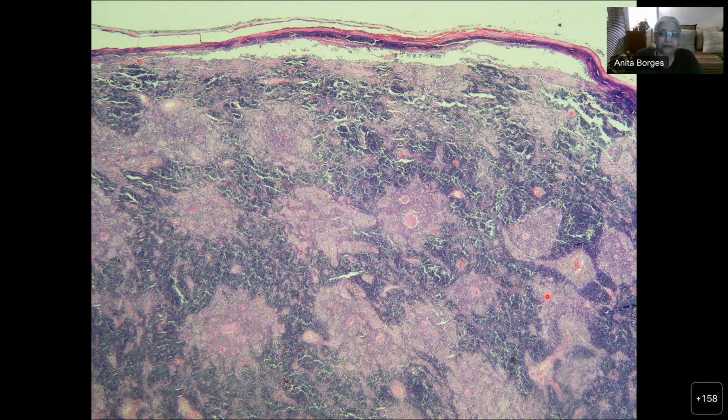See, the dense lymphocytes and the less dense areas in which you see the Hassall's corpuscles, and you can see this like a cortex and a medulla. So everywhere there is a cortex and there is the medulla. And the medulla has the Hassall's corpuscles, and the cortex has these very dense, small lymphocytes.